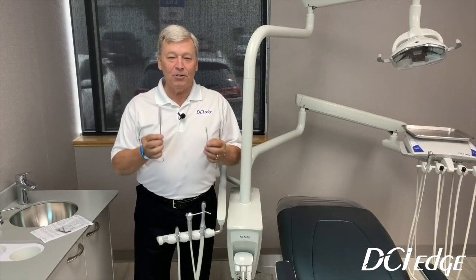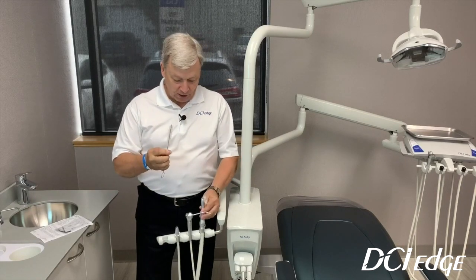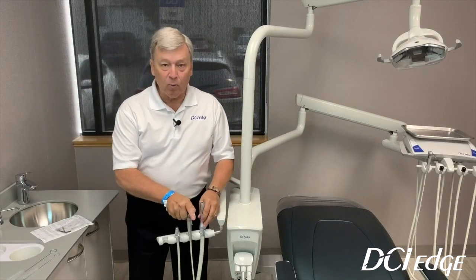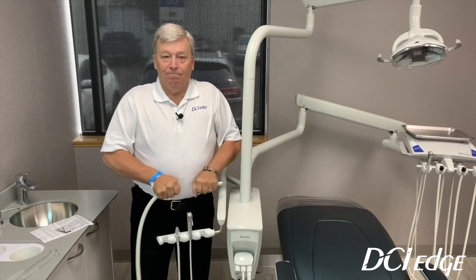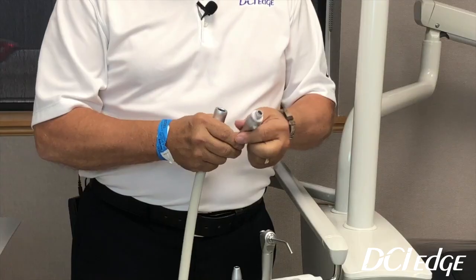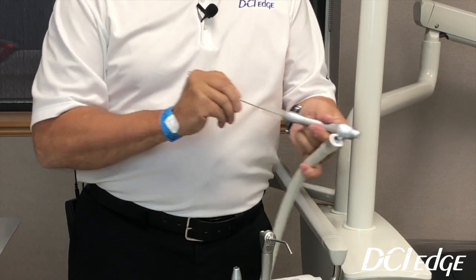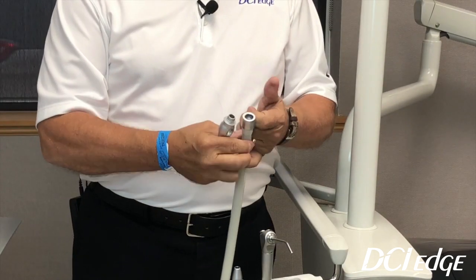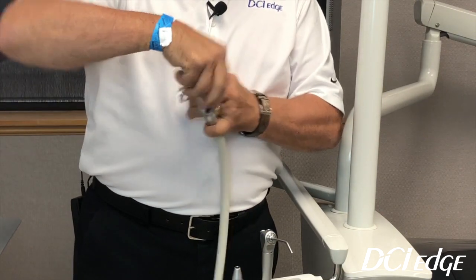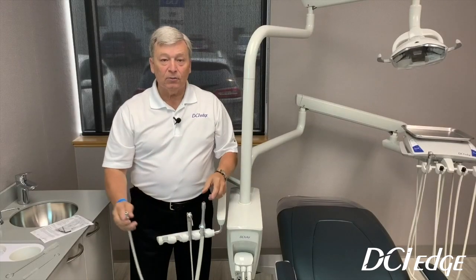We also supply you with two bottle brushes. With each large HVE valve you will get a large bottle brush, and with each saliva ejector you will get a small bottle brush. At a minimum, once a week the valves should be completely pulled apart. You can disconnect them off the hose, then take the large bottle brush, run it through the barrel, run it down through the tip, clean it out, add a little lubricant — whether it be Vaseline or handpiece oil on the O-rings — and then snap everything back together.